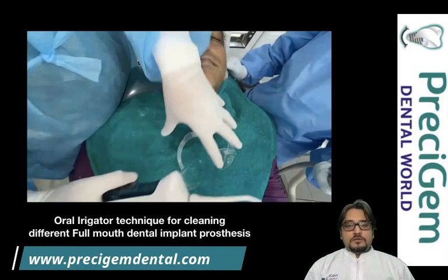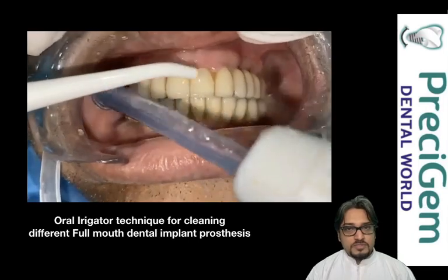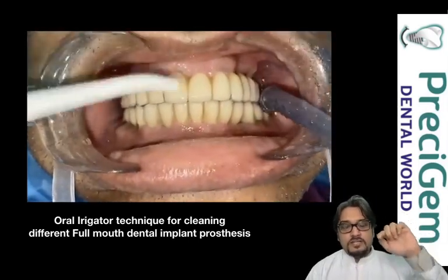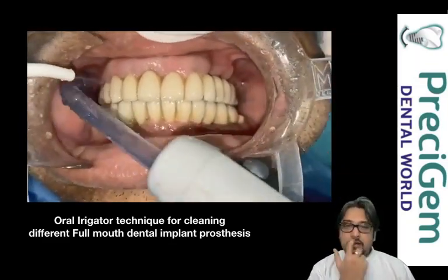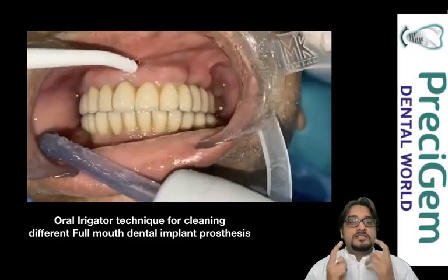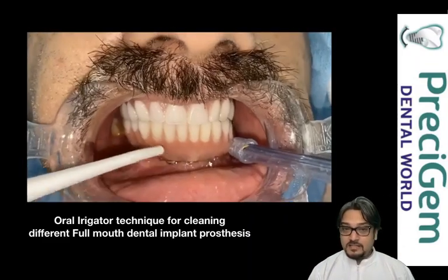I'm going to show you how exactly this is done. For FP1 prosthesis, the water jet concentrates on the junction of your teeth and gums, focusing from the rightmost teeth to the leftmost on the front side. The same must be done on the inside as well.